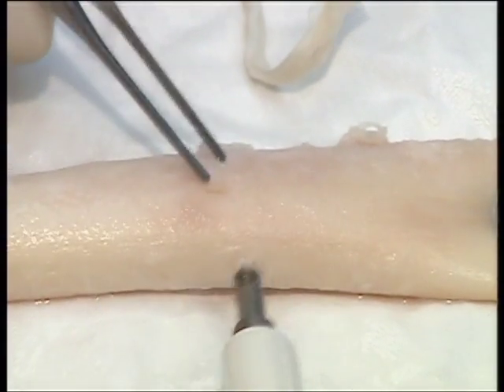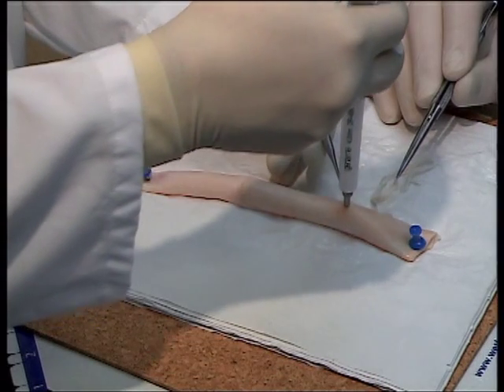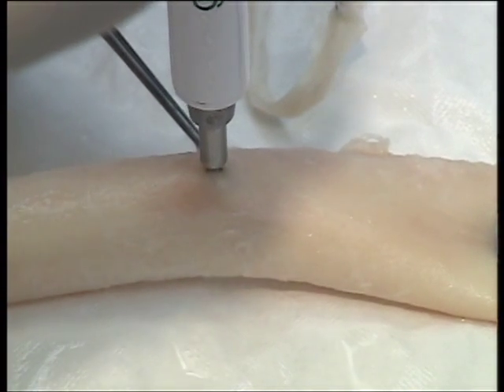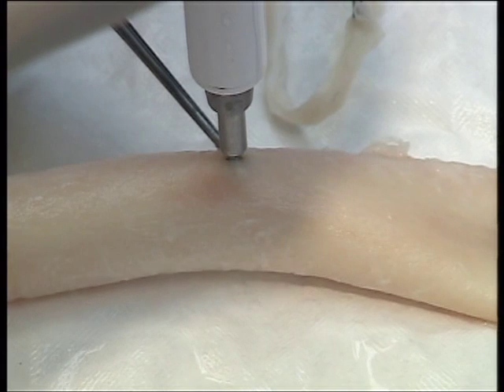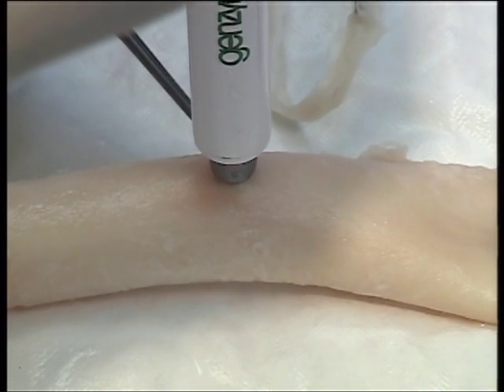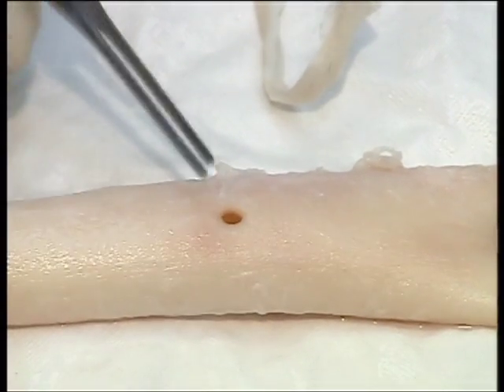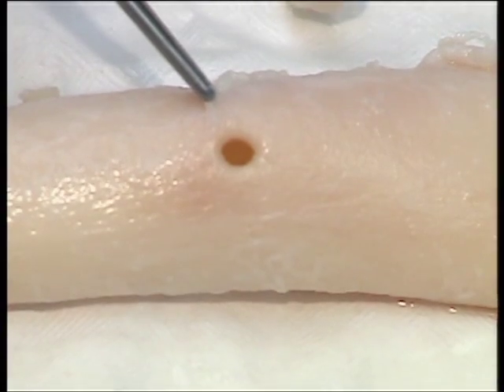Introduce the aortic punch edge first into the incision, pull up on the punch without dislodging it, and engage the punch to create a circular smooth hole.